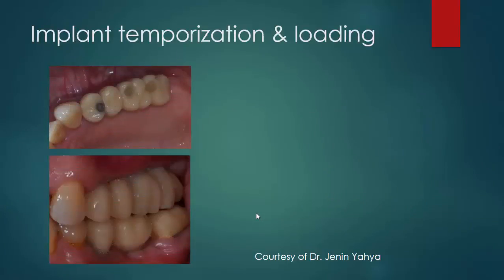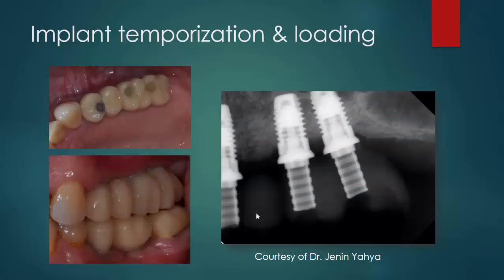And this is to show implant temporization and loading. We can see the temporary, and we see the stability of the alveolar crest surrounding the implant. We even notice the bone surrounding the apical part of the implant.